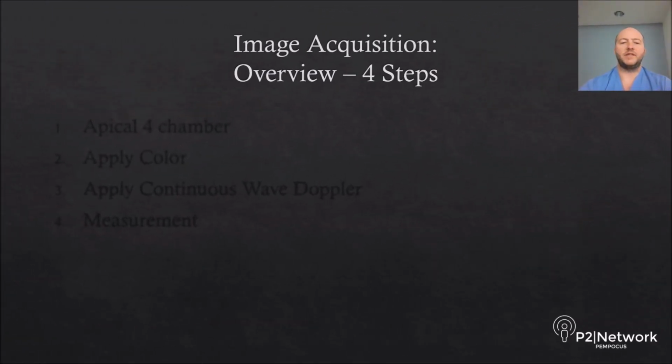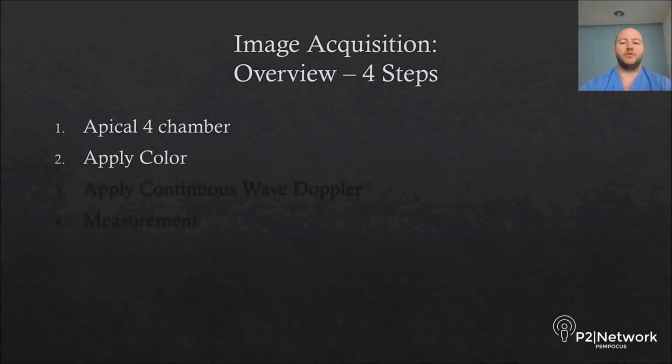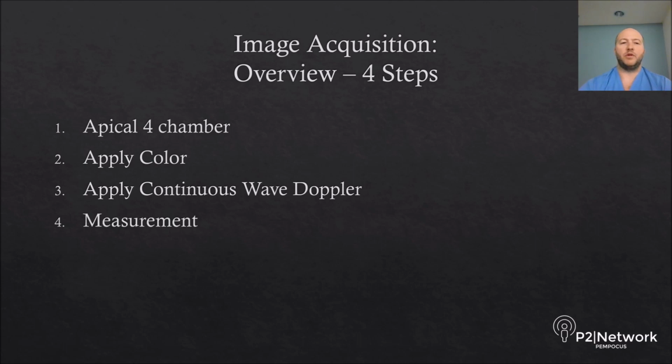There are four main steps to obtaining a tricuspid regurgitant jet velocity. Step 1 is to obtain an apical four-chamber view. Step 2 is to apply color. Step 3 is to apply continuous wave Doppler. And finally, we will obtain our measurement.